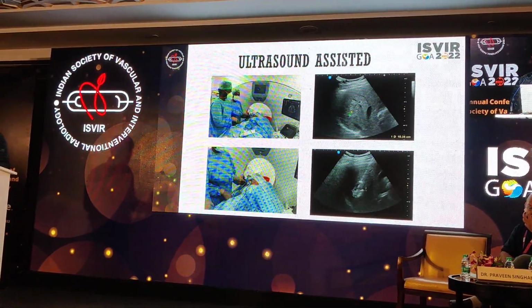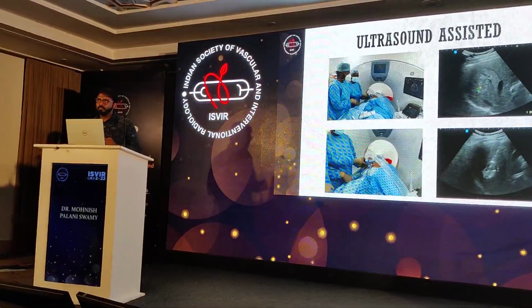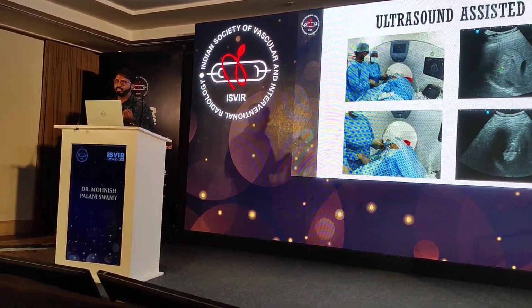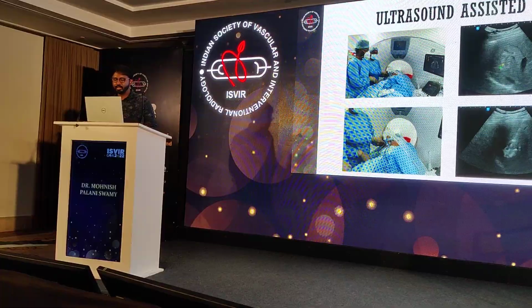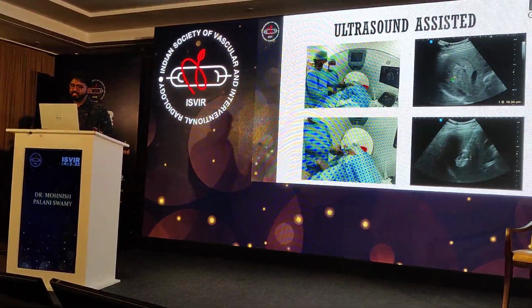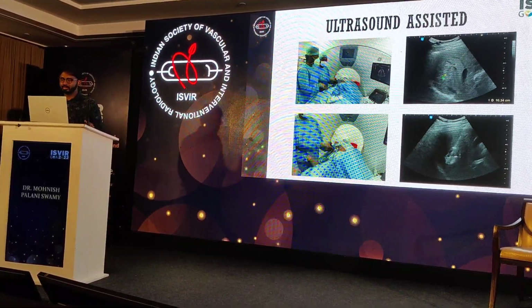I use ultrasound also, because ultrasound comes in handy where, for example, a bowel is coming in between. You just keep the probe on the abdomen, push the bowel out, do an ultrasound guided biopsy on table and confirm on CT as well. So ultrasound assisted CT navigation is very important, and for all ablations I use ultrasound as well as CT.